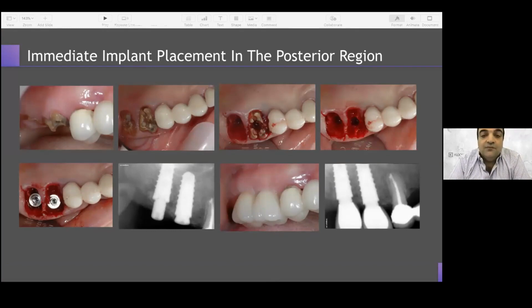For the upper molar, we know that we have 3 roots for this molar. We are going to do the separation of these 3 roots before doing our preparation. At the level of the 7, we did the extraction because it was a one-rooted molar and we could not do the separation. So we do the extraction.